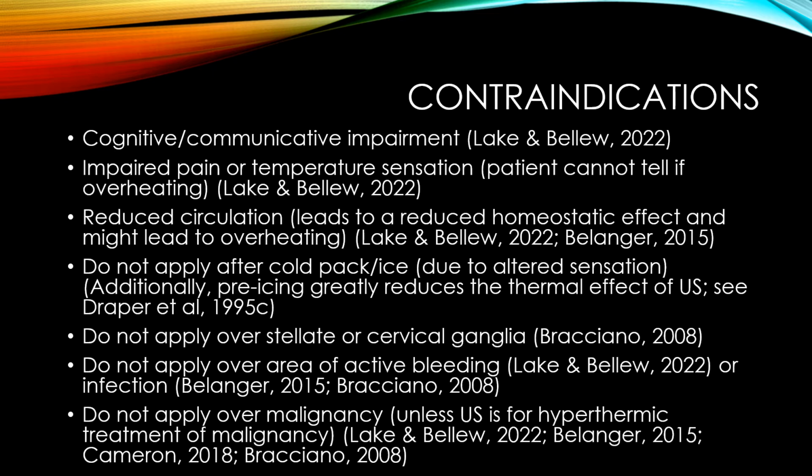With malignancy, it's a little hard because if somebody had cancer in the past, you honestly don't know if they have metastases or a recurrence. So you'd be really careful with that one unless you're sure that they are in remission and they have no malignancy.